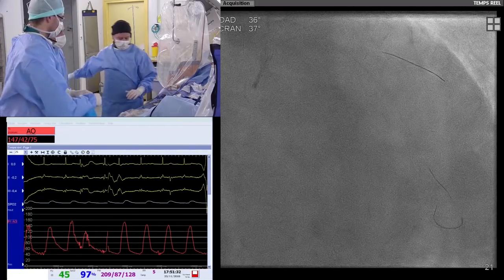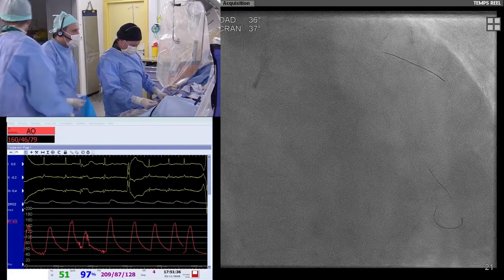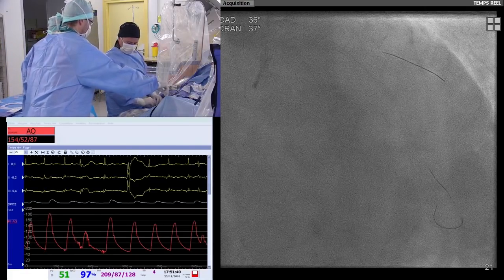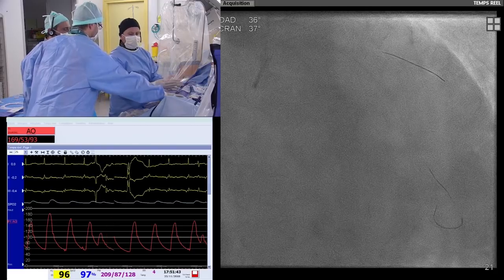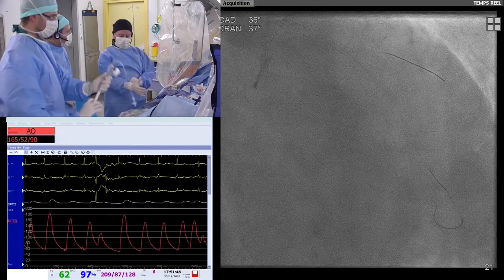I think I agree, because if you need to stent the left main, means taking back this beautiful supportive ROTAWire there. Since we have to put a long stent in the LAD, this is the perfect situation to advance a long stent. So how about now stent selection?